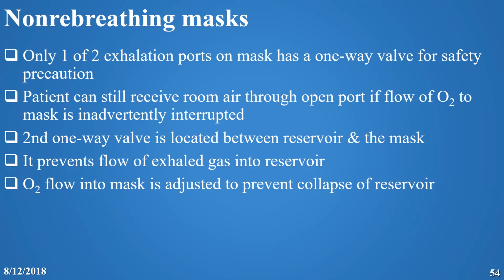The beauty of the non-rebreathing mask is that if the oxygen is closed or decreased or kinked, the patient can still receive air or oxygen from the one side port. There is always a one-way valve, another one-way valve at the gate between the mask and the reservoir.